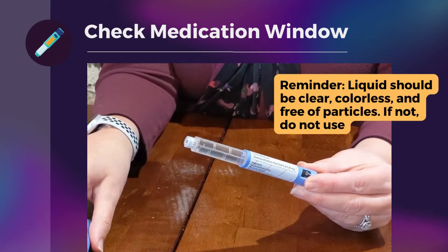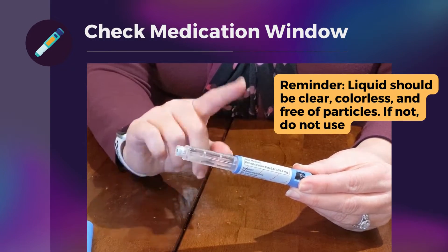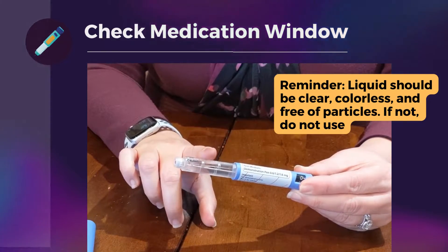This pen cap you're going to remove. You always want to check any time before you give your injection that this is a clear fluid solution, that there are no particles and no discoloration.